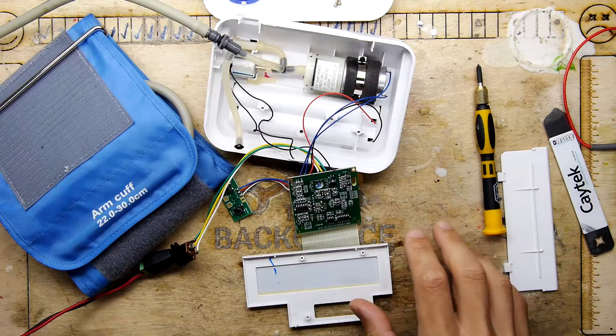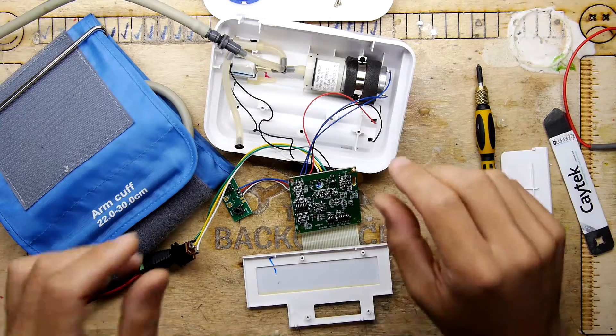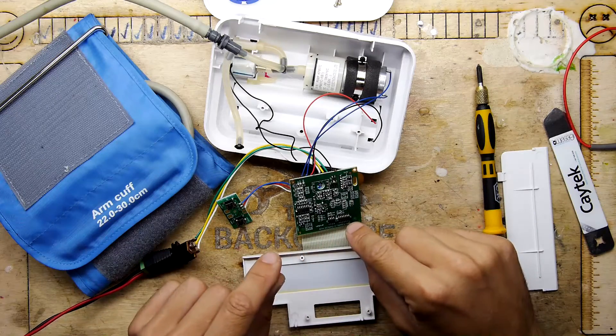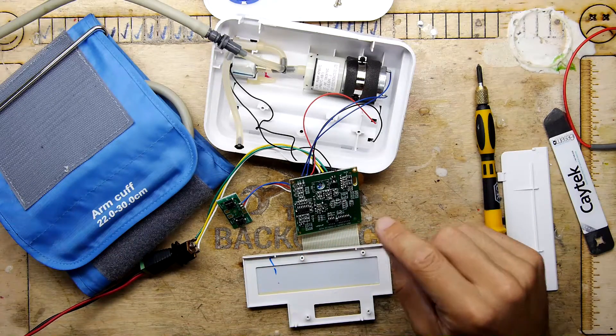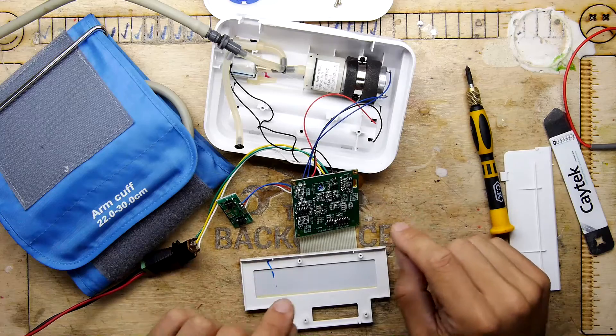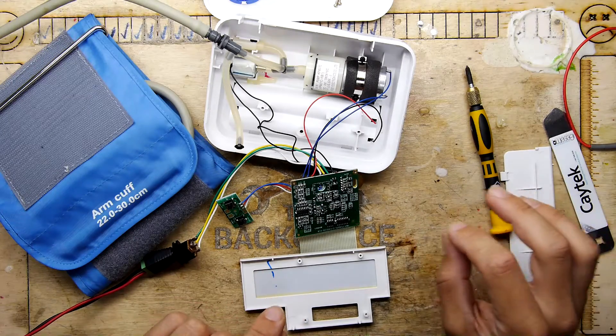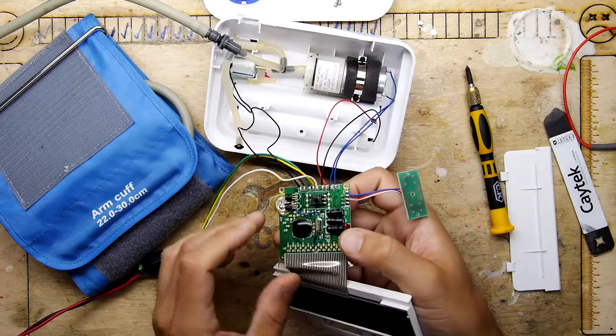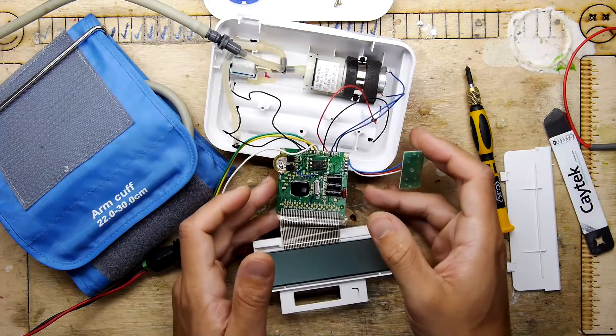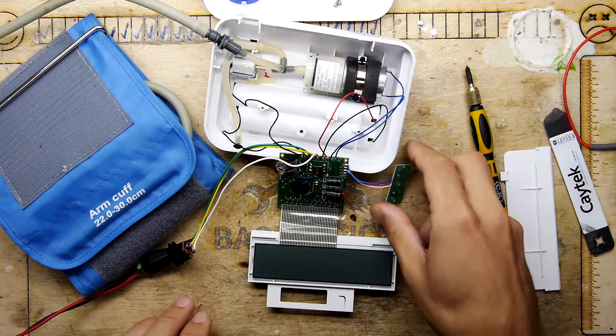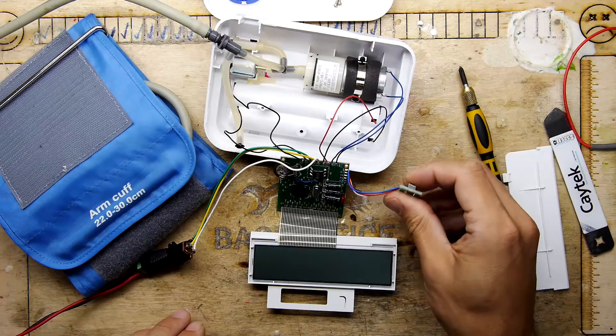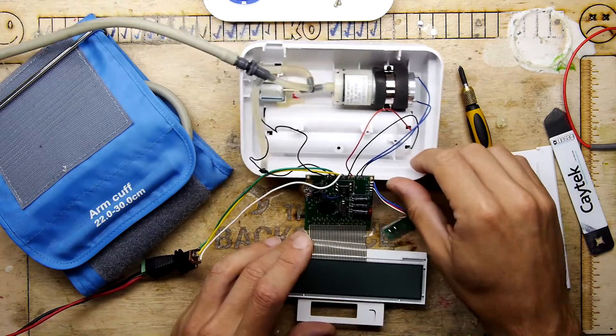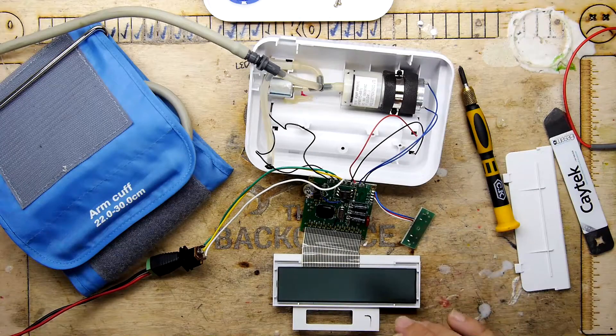Okay, I've gone through the circuit at a very high level. There's power to the switch. There's power going to the main components. So it doesn't seem to be a fuse there that I can see at least. So it's one of those things where it's going to be like a dead component. And that could be a dead transistor, dead microcontroller. Beyond at the moment, probably the time I'm prepared to spend on something you can pay 20 quid for.